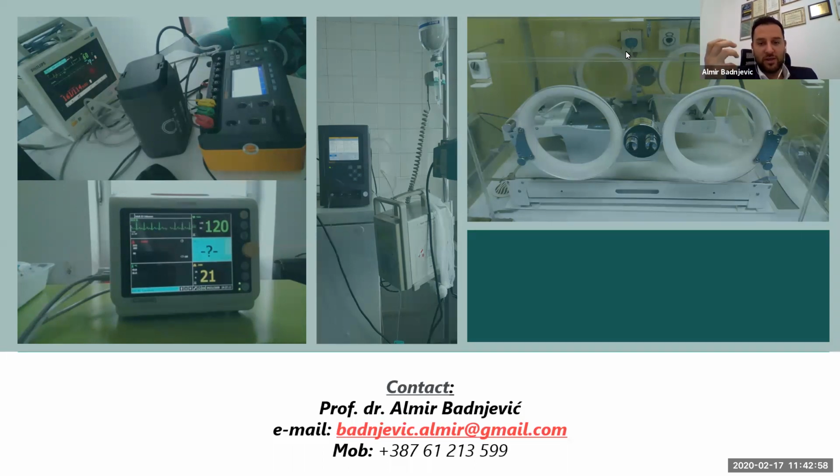While in verification, you use a much more accurate device to check whether the one equals the two, etc. And the second question is, don't you think that ISO 13485 should be the standard for medical device labs who perform verification and maintenance, and ISO 17025 for those who perform medical device calibration? Yes, in fact, medical device calibration and any kind of calibration is done by a laboratory for calibration. So whether it is a medical device or whatever, it's 17025, while 13485 is the standard for quality assurance of medical devices. And of course, it doesn't touch any labs or anything similar.